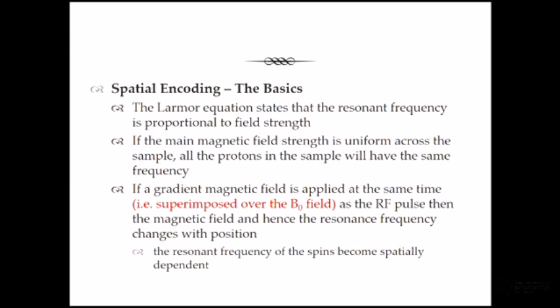So on CT, you put a person on a table, you push them through the imaging gantry, and you basically slice them up along the body. There are a few variations. You can get close to doing direct coronals, say for facial bones. If you put the patient on the table, on their abdo, head extended, angle the gantry, you can get close to doing some sort of direct coronal imaging. But that's about the limit with CT.